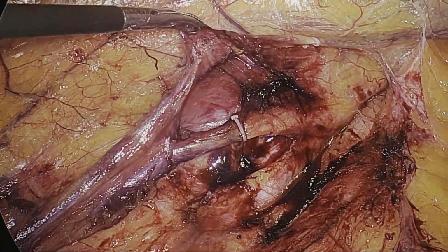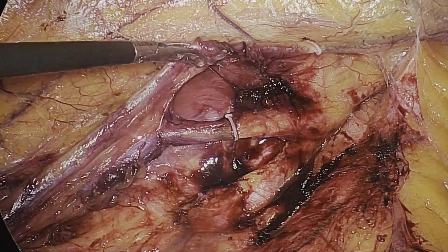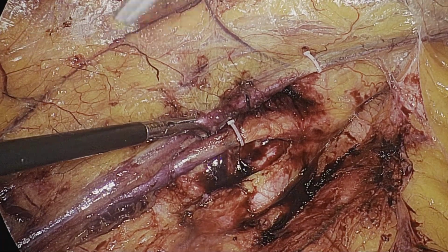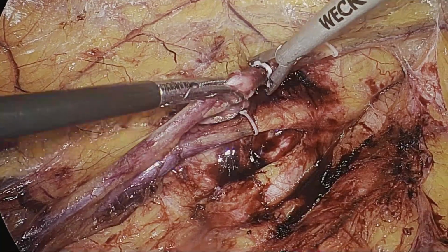Now the gonadal vein and the ureter have been clipped. So we'll apply another clip and cut in between. This will complete the nephrectomy, and then the specimen will be mobilized all around.